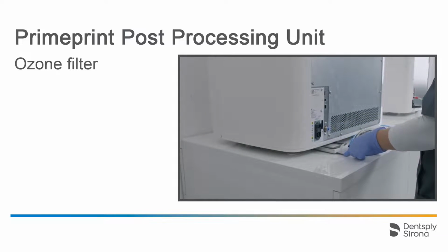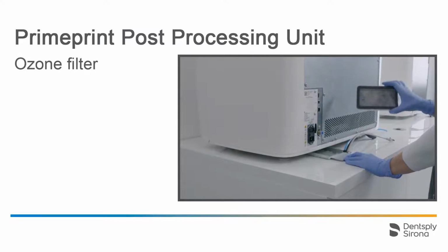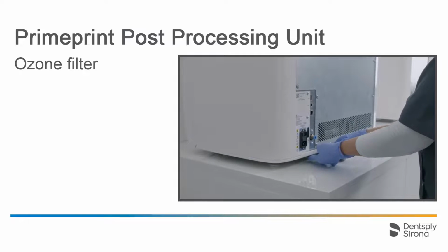We pull out the drawer containing the ozone filter, remove the used filter, and discard it. We insert the new filter with the foam margin facing up into the perforated metal sheet and push the drawer back inside until the stop.